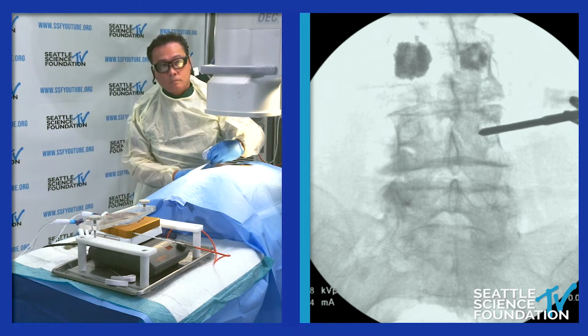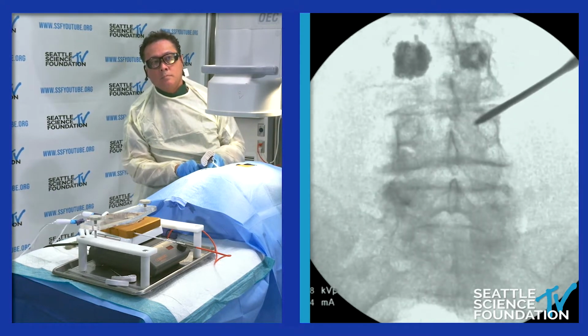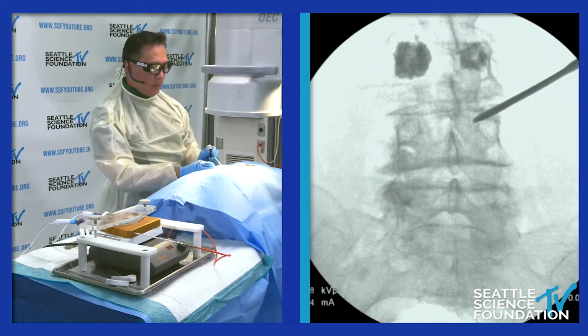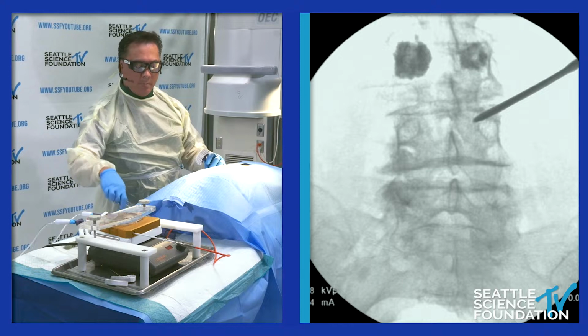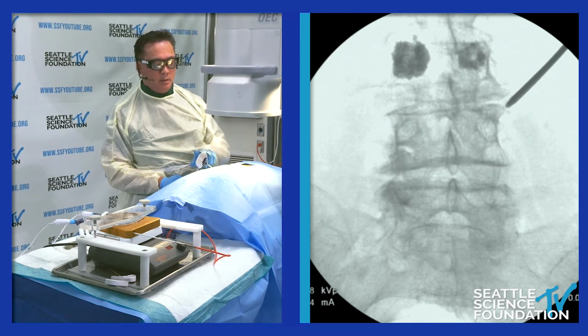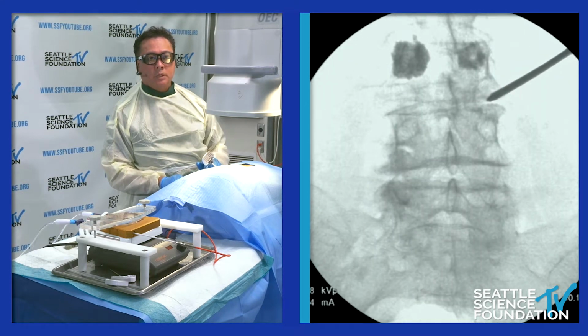And let me ask you, right now you're doing a vertebroplasty. Do you always go bilateral or do you go unilateral? A lot of times I will go unilateral if we're getting good access, but in terms of providing a good ablation zone, it's good to actually do a bipedicular approach, depending on how big the tumor is you're trying to ablate.